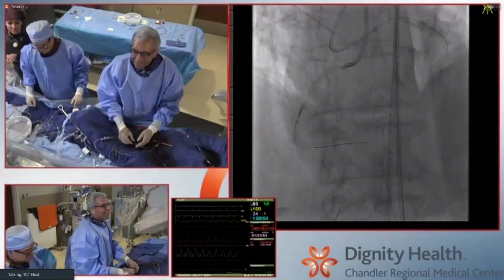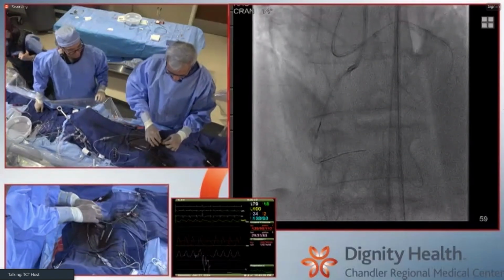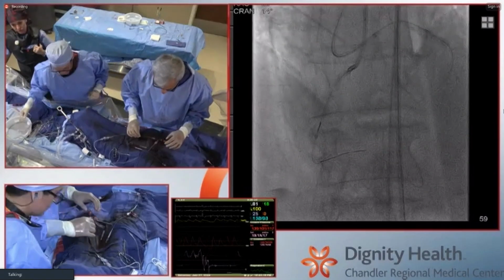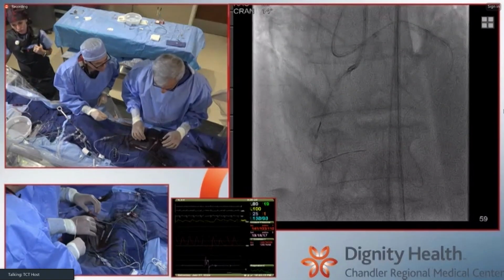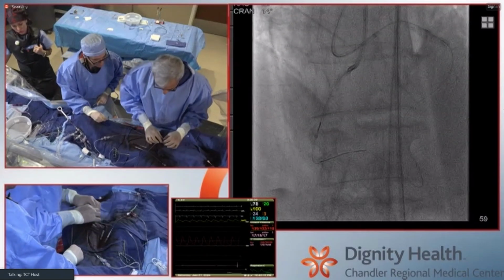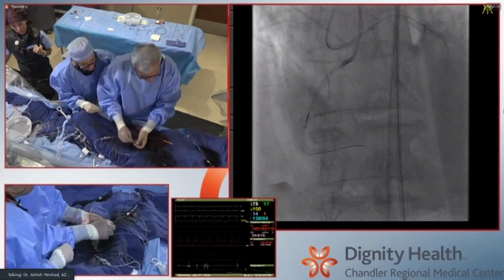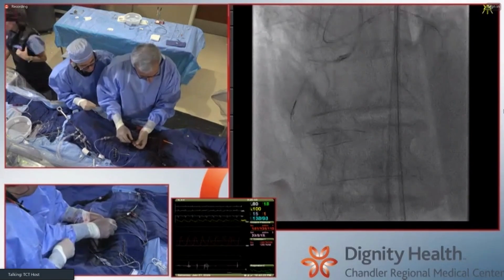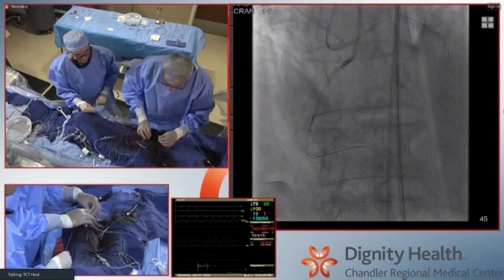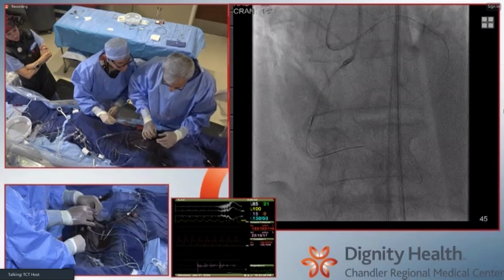So one interesting approach is to pull the trap liner back so it's sticking out from your antegrade guide. What it ends up doing is filtering your retrograde wire right out through the trap liner and into the world without having to clamp the antegrade guide. Yeah. I picked that up from Bilal Iqbal recently, and it's a peripheral trick, right? That I'm sure you're very familiar with when you're sort of sheath and sheath. It's good, but he fought to get the trap liner where it is, and there are other ways.